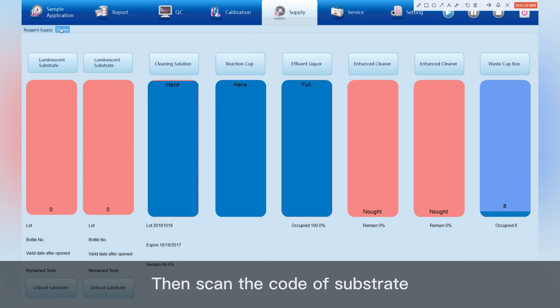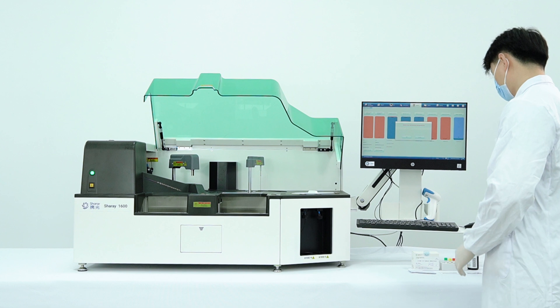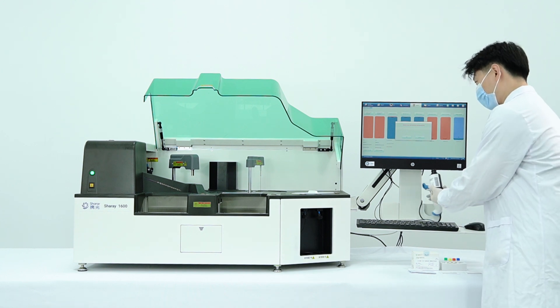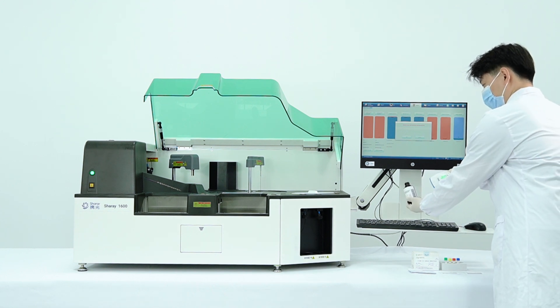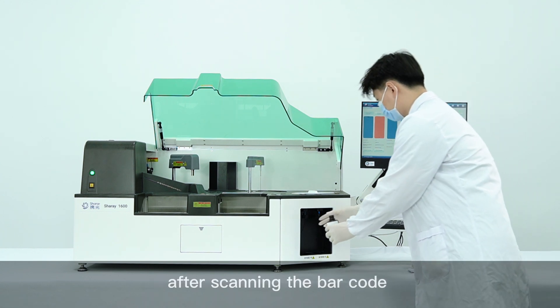Then scan the code of the substrate. Put a new bottle in the substrate bin after scanning the barcode.